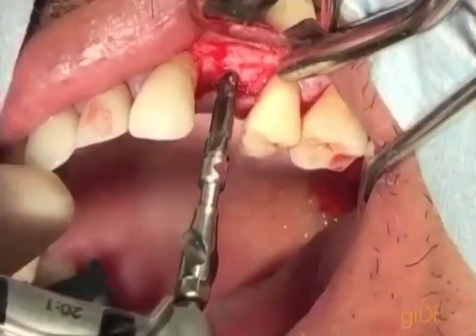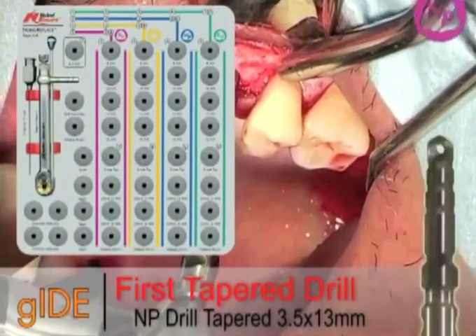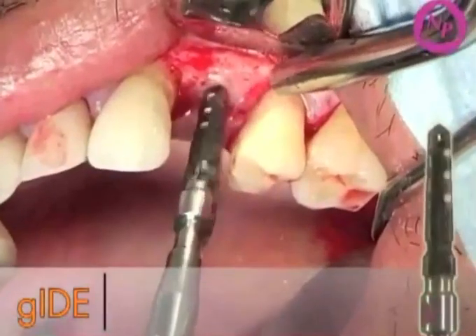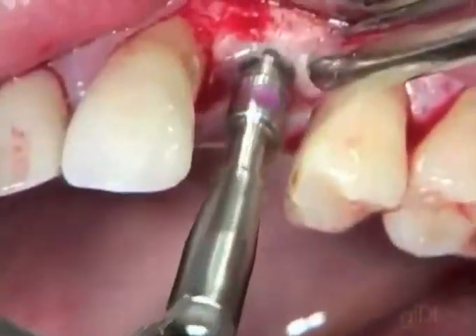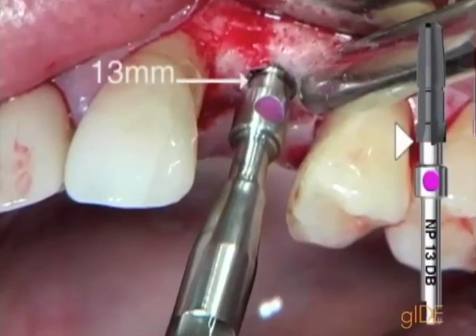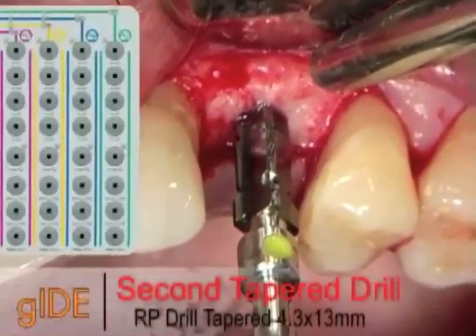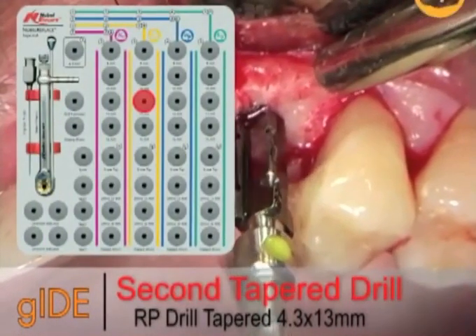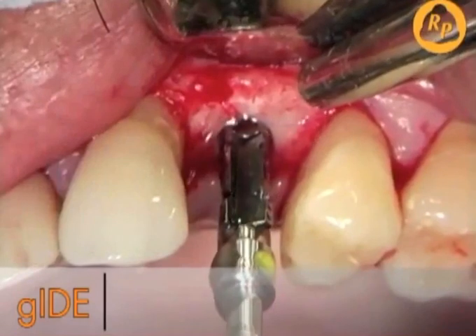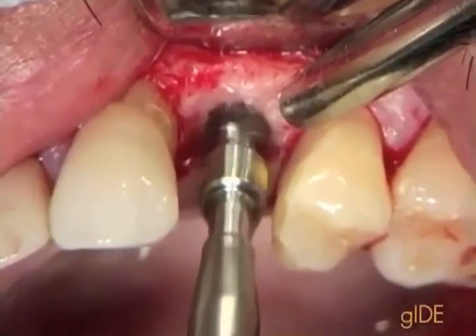which was chosen. The next drill is a narrow platform taper drill, 3.5 by 13, which is guided into position to final depth, where you can see here the final depth to be 13 mm for the next implant placement. The regular platform taper drill used here is a 13 mm, which is guided into final position, again at the crest of bone.